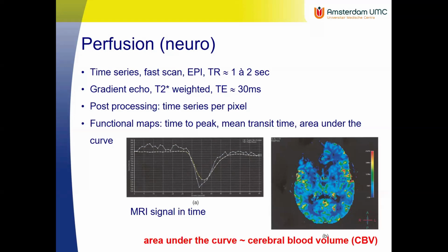Okay, so we have this curve. And then what is happening quite often is that you fit a parameterized curve to the measured one to get a more smooth solution. It turns out that if you do a mathematical modeling and calculation, that the area, I would say the area above the curve. Usually you have a curve which is upside down, then it would be the area under the curve, but now it's above the curve.